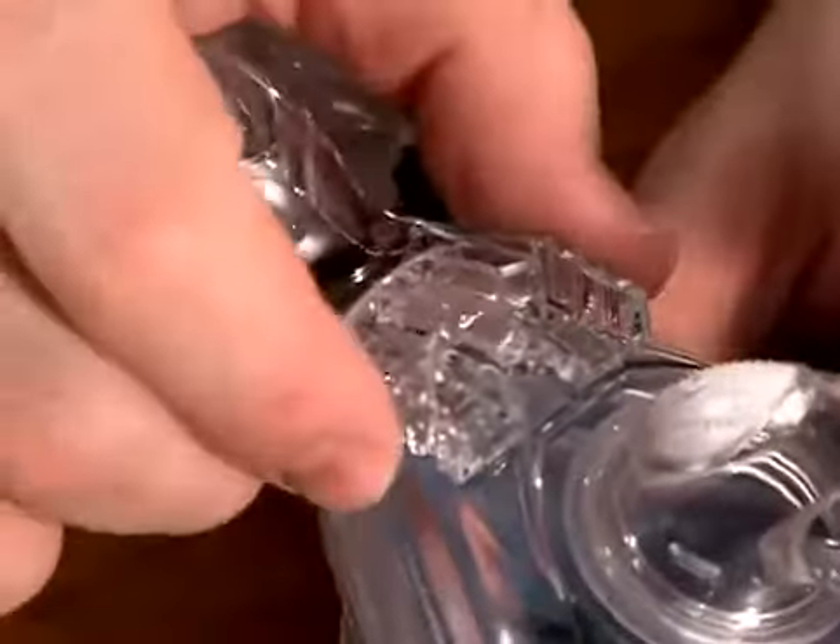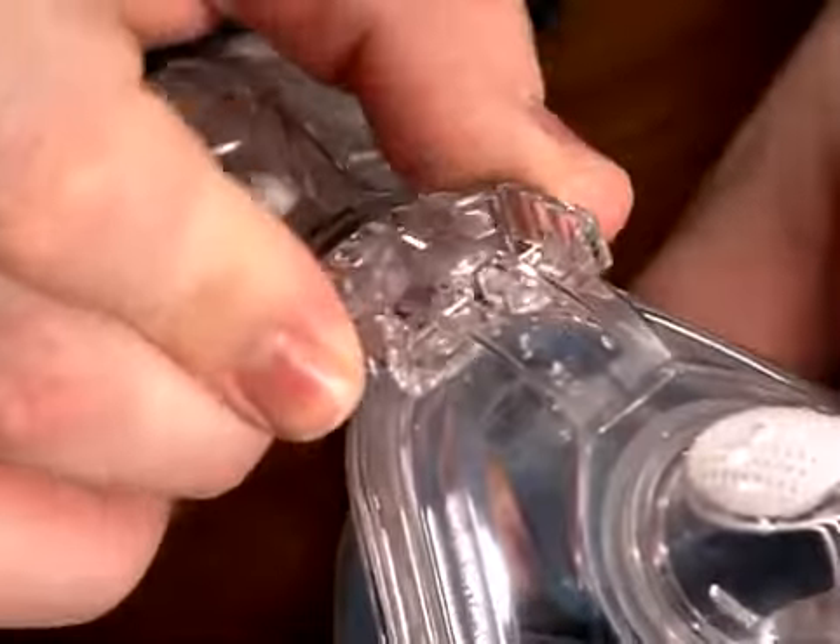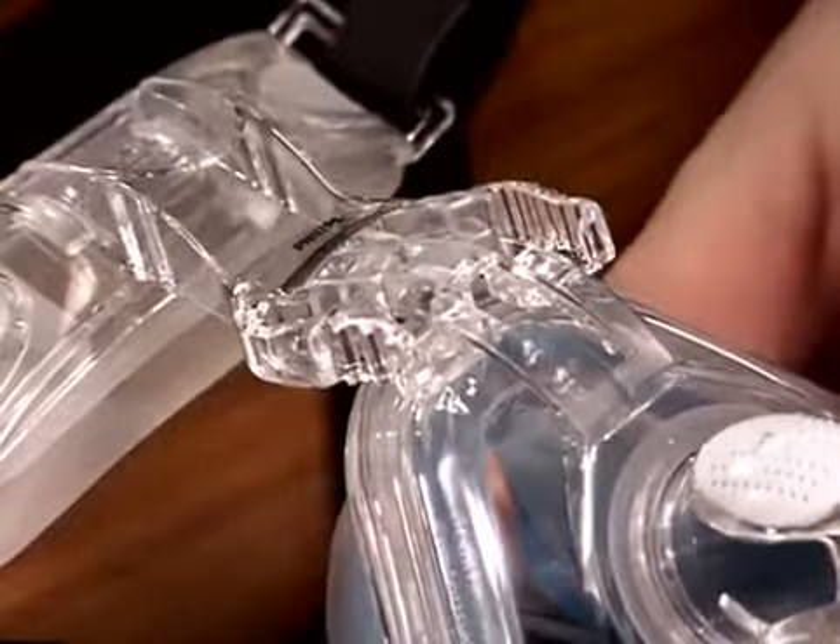Squeeze the sides of the stability selector while moving the forehead support arm upward to the highest position.